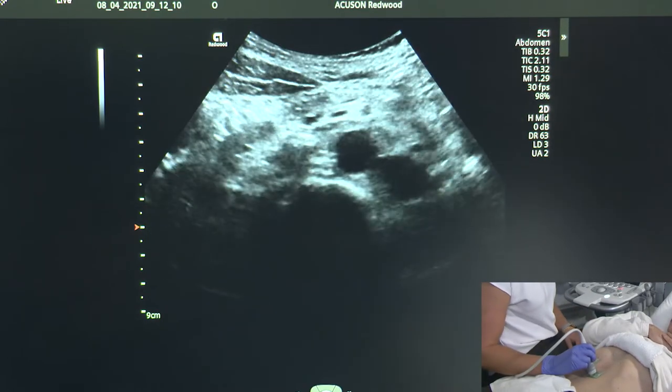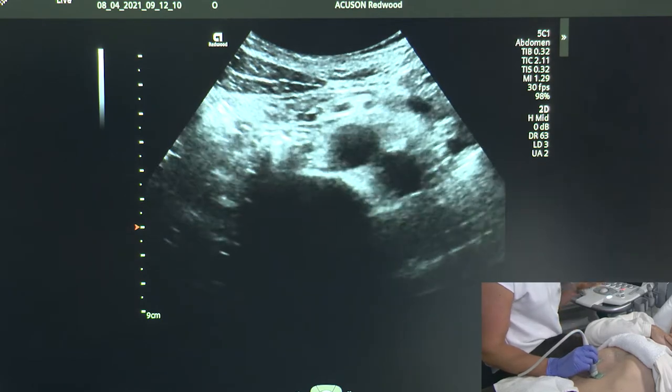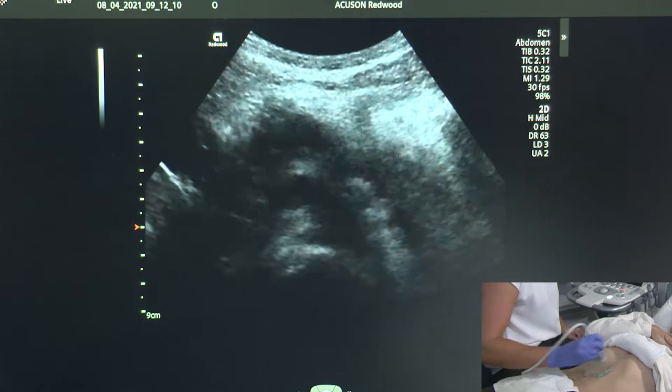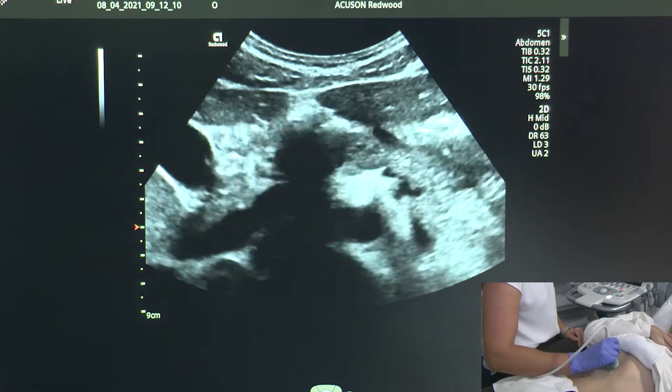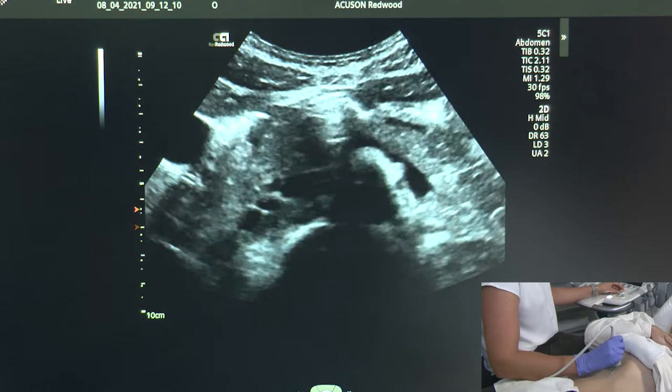What's really important when we're scanning is that we scan in two planes and that we image every single part of the pancreas independently. A lot of the time sonographers will only take images in the transverse plane, but you can also take images in the longitudinal plane.